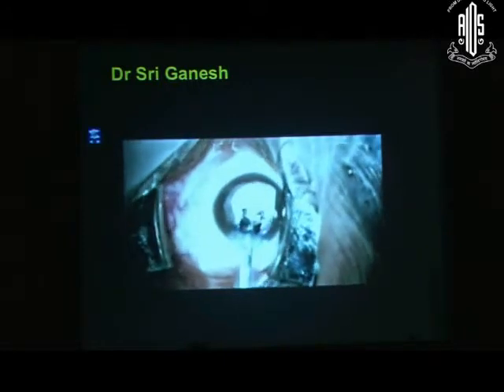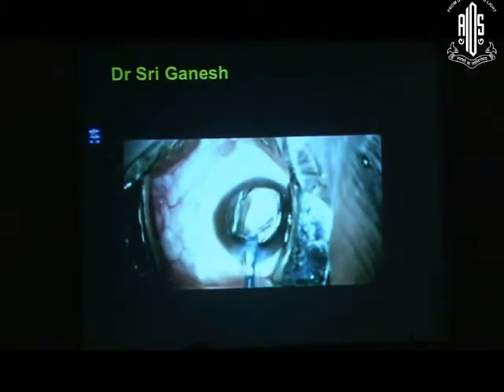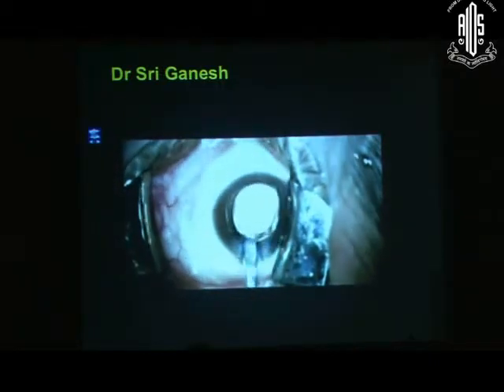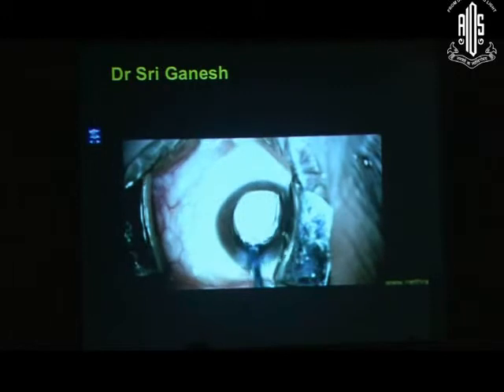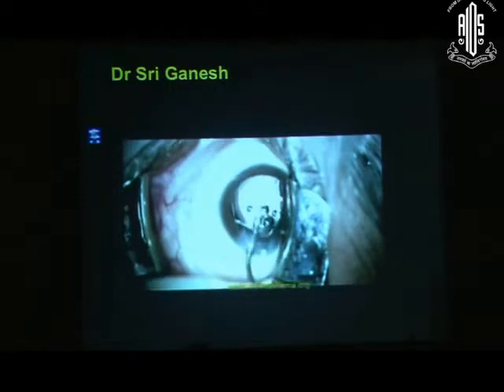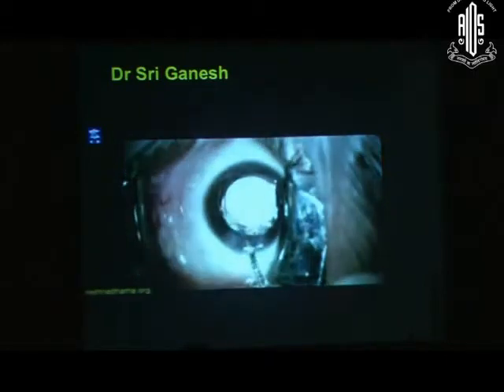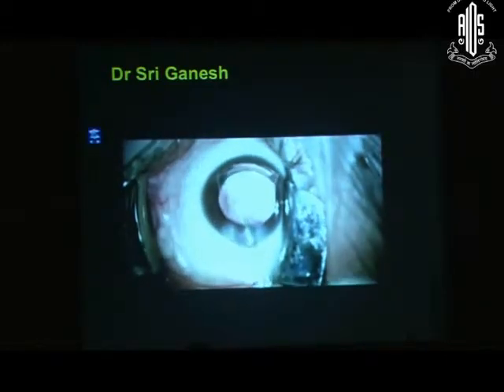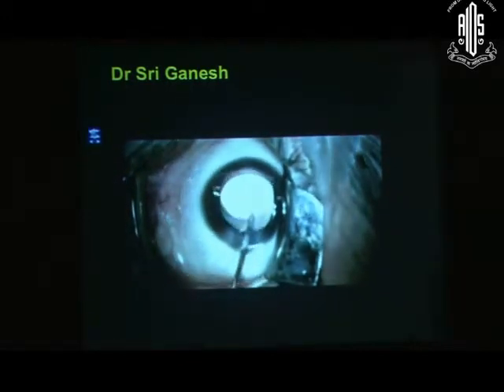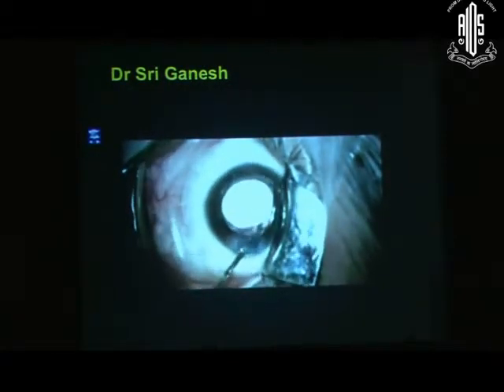The viscoelastic between the ICL and the cornea acts like a cushion and even prevents the fluid from hitting the endothelium. It's like a hood, and it maintains the integrity of the endothelium there. That's the lens being inserted, and after that I just have to go in and tuck the proximal haptics back into the sulcus. So we have two lenses there, the ICL and the IOL, and this patient actually had a good postoperative outcome. He had a residual power of about 1.5 diopters and 6/12 vision with the correction.